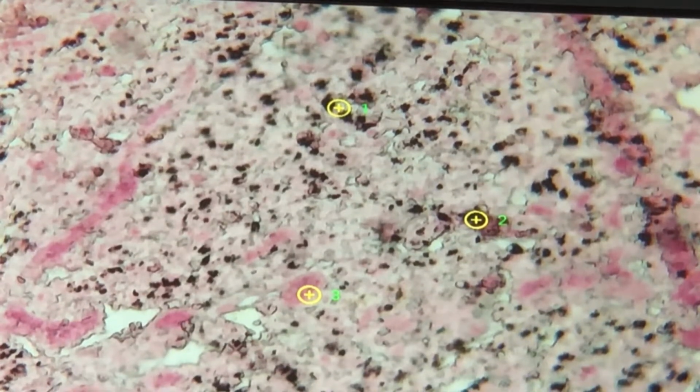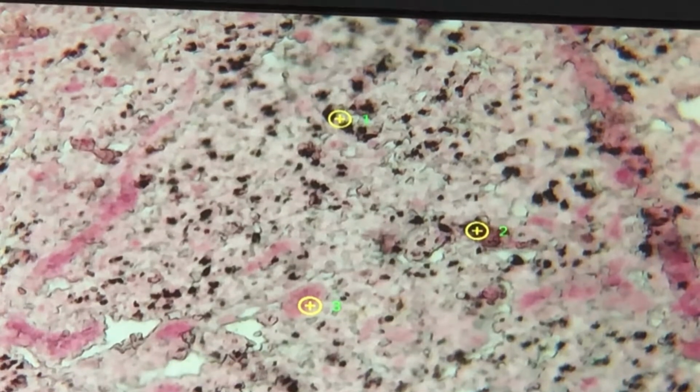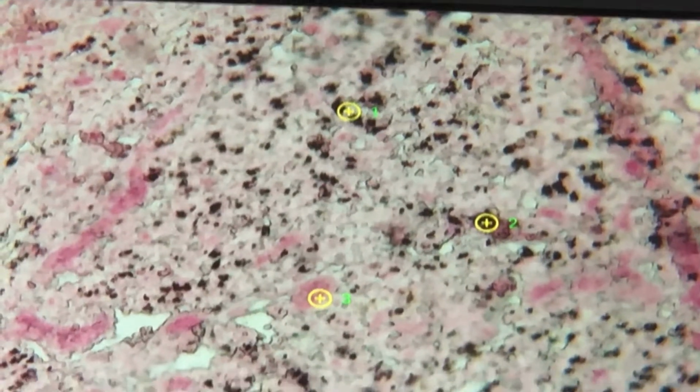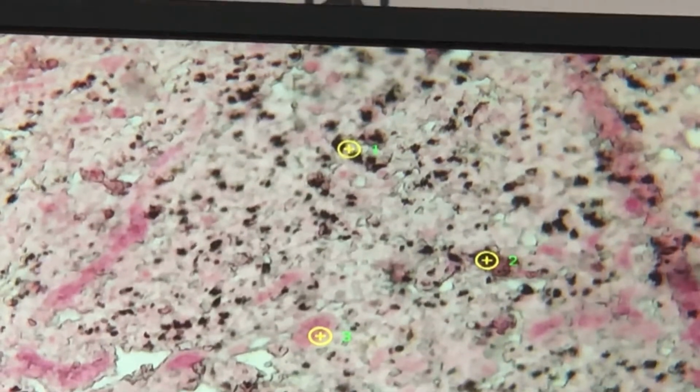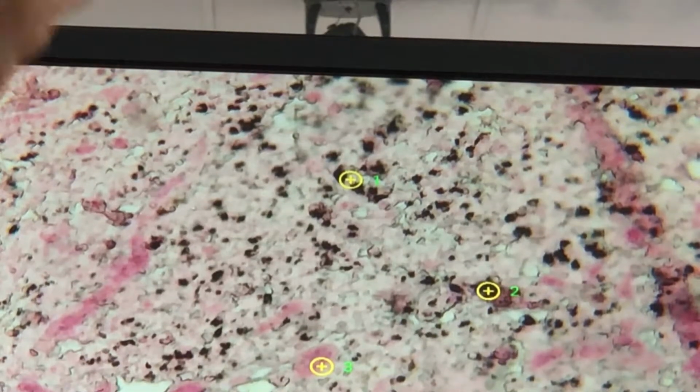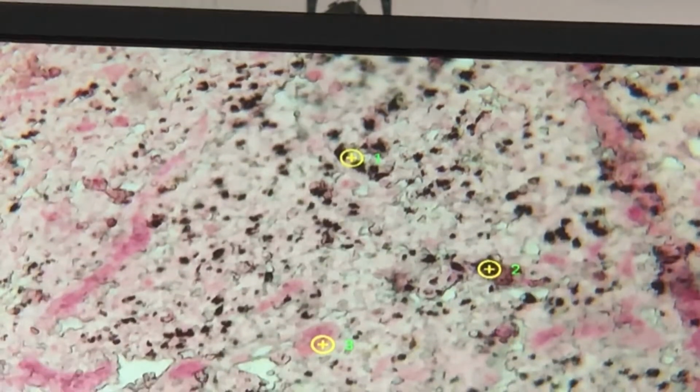a substance. It's not a pathologic process. Anthracotic pigment is not a pathologic process. It's a substance that is infiltrated in that area. So that's why it will give you a dirt or black color. Like that. So any question with this slide, very easy to identify.